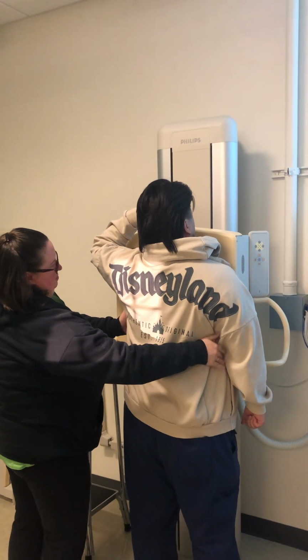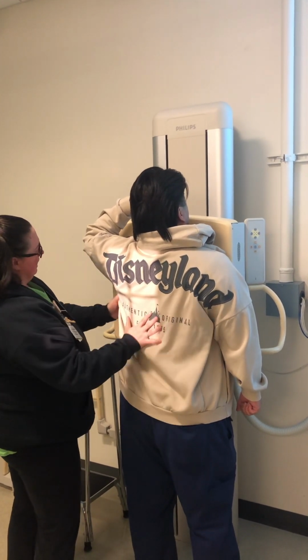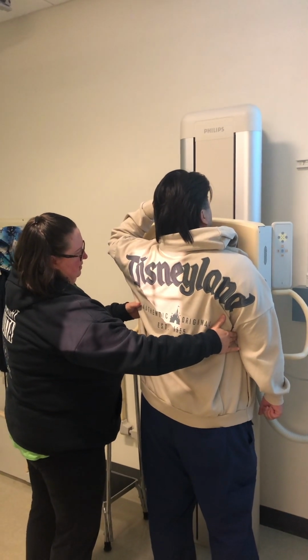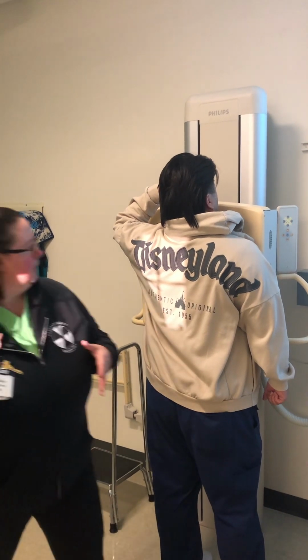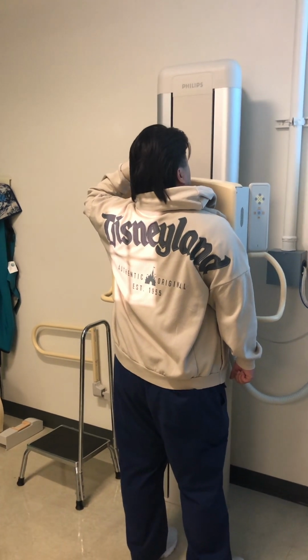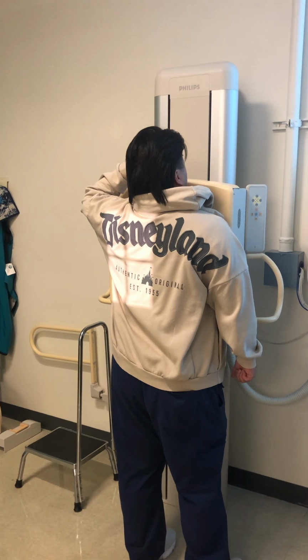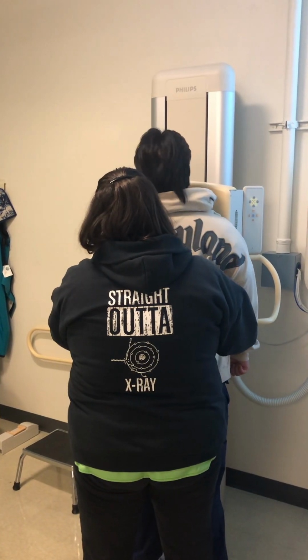It's not uncommon for some places to want a lateral rib too. It's not technically part of the routine. Again, that would be based solely on physician preference, but it's not a normal part of the routine. So again, deep breath in and hold it. Breathe and relax. And then keep your arm up.